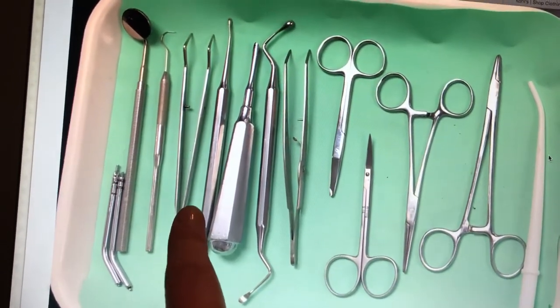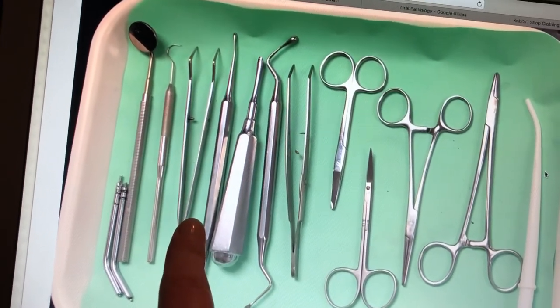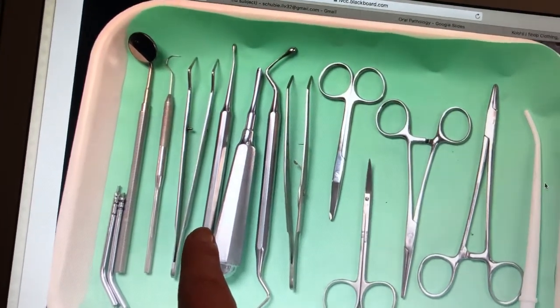We have cotton pliers forceps, which are going to be used to retrieve any instruments, materials, or anything else that we need from the back counter. Then we have a perio steel elevator, and that's going to be used to separate the tissue from the bone.